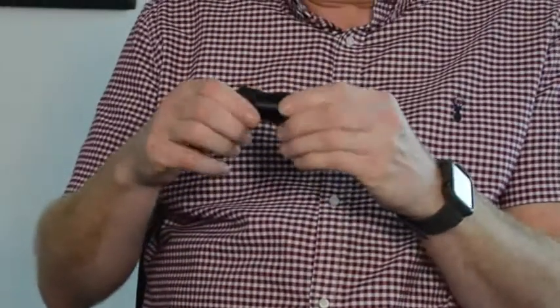So about the monocular. That becomes a real solution, because no one wants to carry a pair of binos around with them. Not judging by the pair you brought in. The thing with a monocular is, I've got a monocular here. They're really small. That's one I used to use. Unfortunately, it's not much use now for me. But this is a little monocular, about 4 times magnification, but it's just for one eye, which quite conveniently works for me because I've only got one eye. Monoculars are something we would think about for possibly outdoor use.